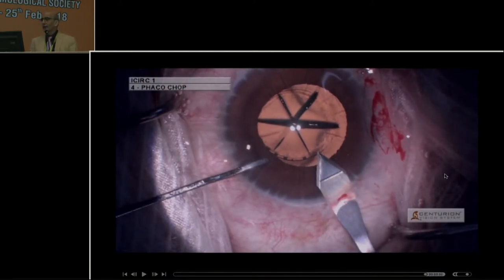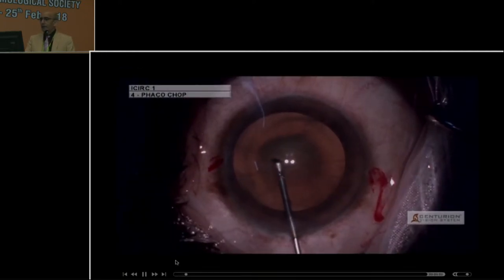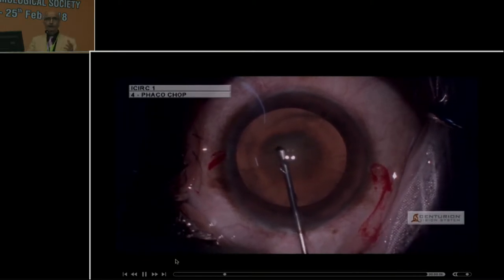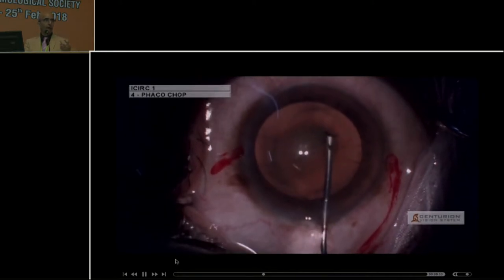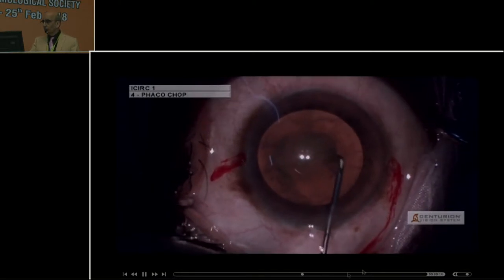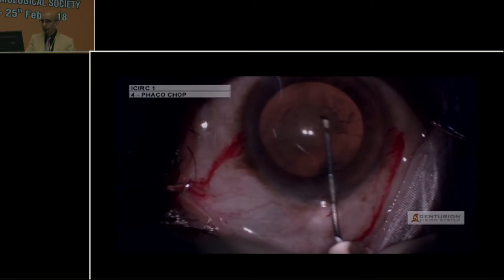You need to be scleral or more limbal with your approach. These are eyes where you will need to address the incisions at the end — look at the multiple incisions that they have. When performing rhexes in myopic eyes, if you think you're creating a 5mm rhexis, you will end up with 5.5 or so because of the magnification and depth. Try to aim a little smaller than you would normally, and you will end up doing the same size at the end.